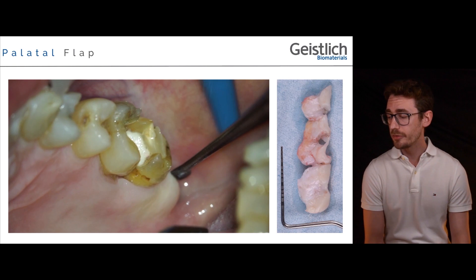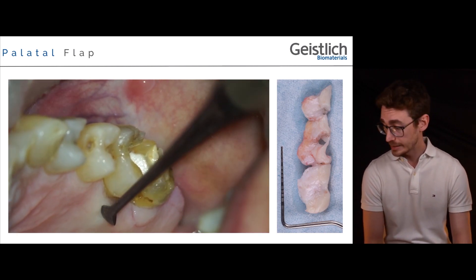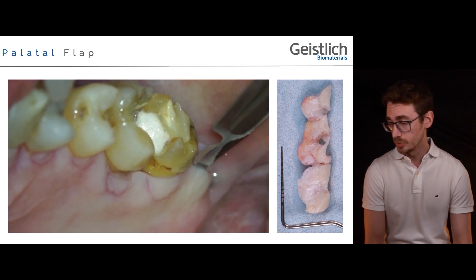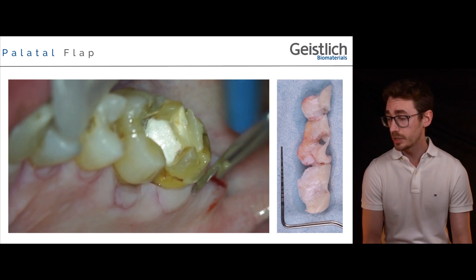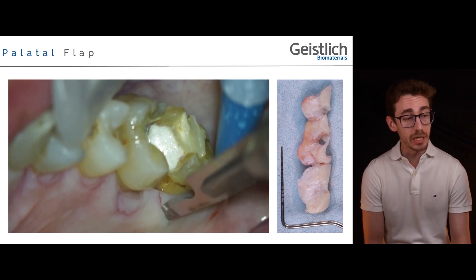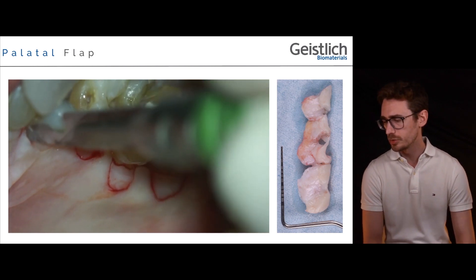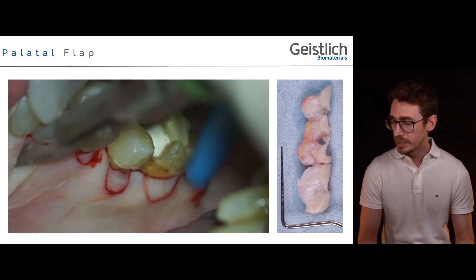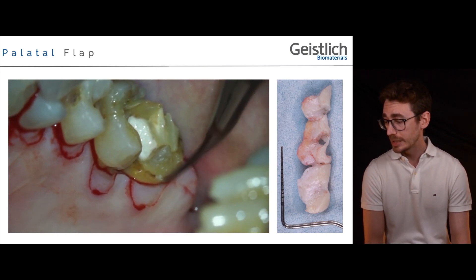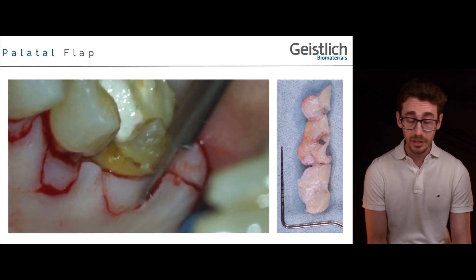Once we have designed the two parallel incisions of our distal wedge, we move to the palatal aspect of our sextant, and with a sharp periosteal elevator we start to design our incision outline. This outline is then followed with the 15C blade, which allows us to sculpt our primary split-thickness palatal flap. We are anticipating with our paramarginal incisions the final position of our flap once the bone will be finalized and the osteosurgery performed. Moving to a 12 blade achieves a better parallel angle to the bone, and we start to elevate split-thickness papillae at the interproximal level and at the level of the distal wedge.